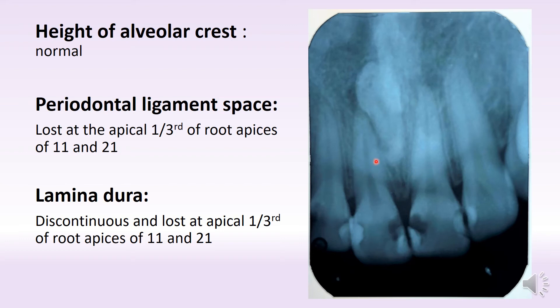But the two teeth which are very clearly visible are 1-1 and 2-1. If you look at the apices of 1-1 and 2-1, you will see that you can follow the line of the PDL all the way up to the apex — up to the apical one-third — but somewhere at the apical one-third it gets blurry and you can no longer see the PDL and lamina dura.